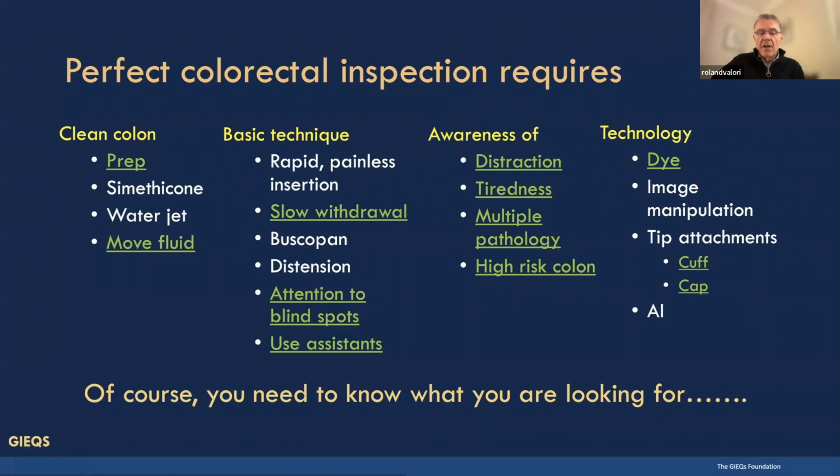And very briefly, obviously, prep is critical. Mike Burke in GIEQs last year, the symposium, really emphasized the importance of use of simethicone.